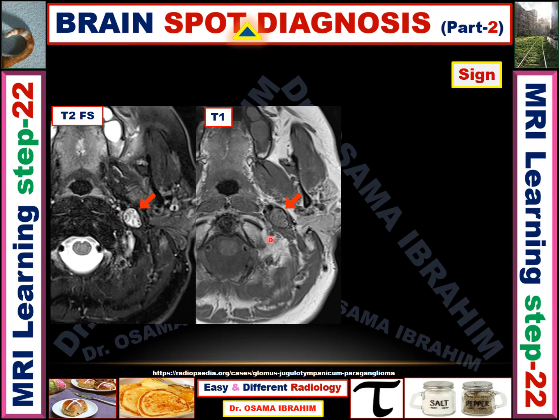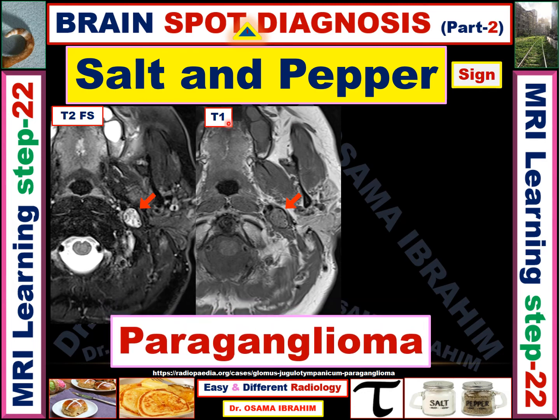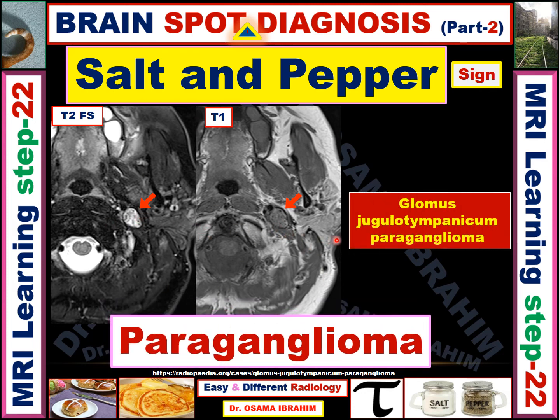If you get the correct name of the sign, you can make the correct differential diagnosis for the lesion. These lesions are at the carotid space and extending to the jugular region. They have high signal on T2 and there are multiple spots of signal void or low signal — this looks like salt and pepper. This is called the salt and pepper sign, due to signal voids representing vessels and dots of high signal representing hemorrhage or stagnation of blood within the vessels. When you find the salt and pepper sign at the carotid space and jugular space, it represents paraganglioma — specifically, a glomus jugulotympanicum paraganglioma.